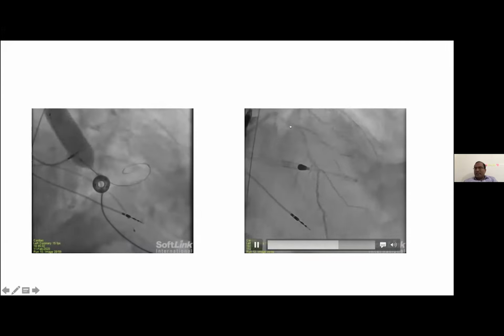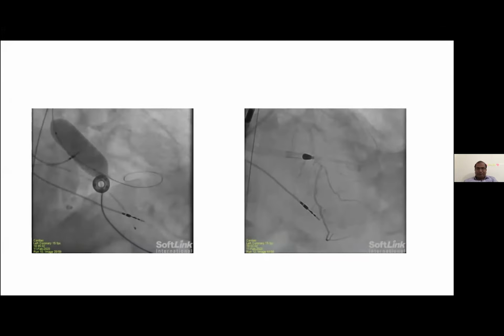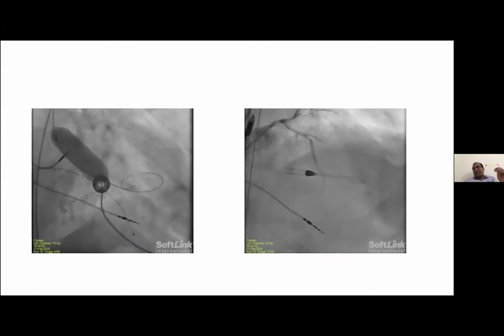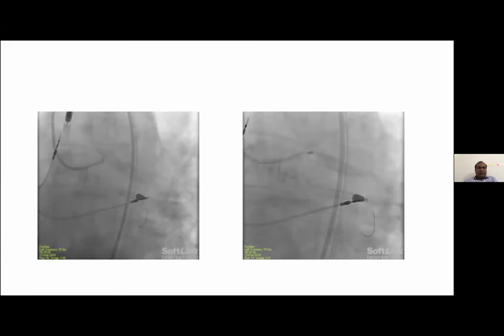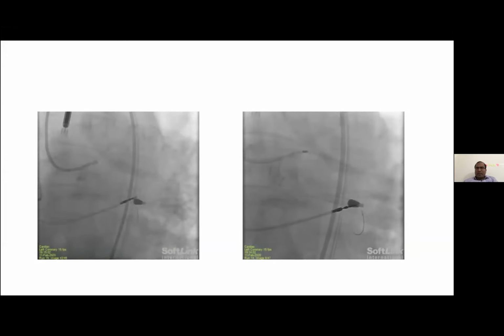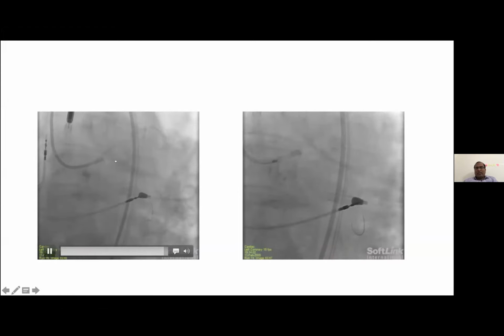This is the guide shot for the coronary anatomy of the left coronary system. You can clearly see a long critical disease in the distal left main 111 lesion that extends into the LAD proximal segment 2. So this is the RAO caudal shot, again showing the critical distal left main pathology. The flow was much slower, kind of TIMI 2 on the circumflex system.